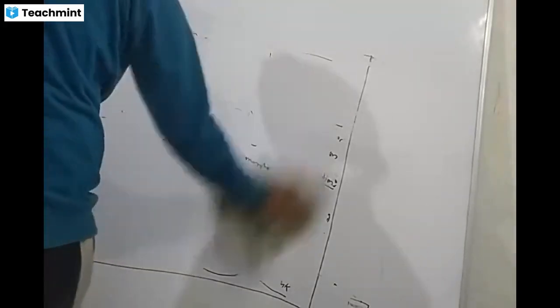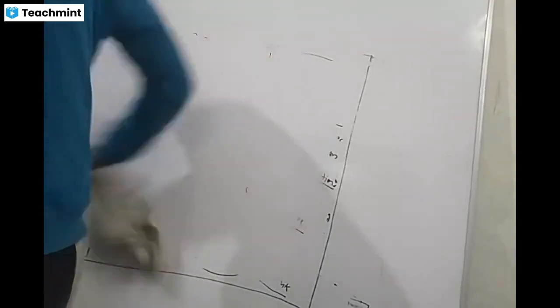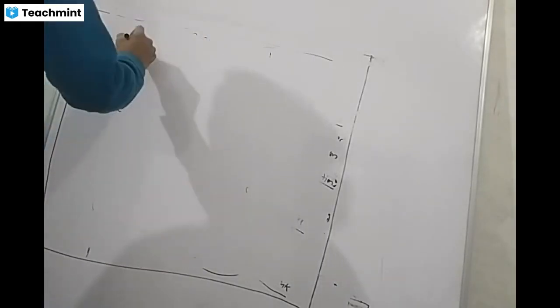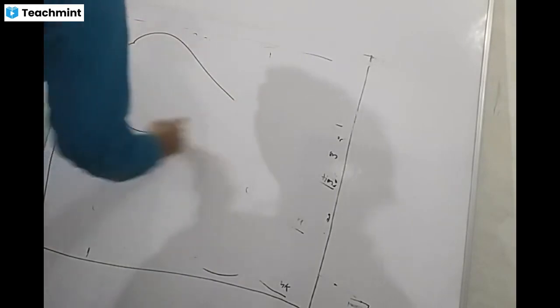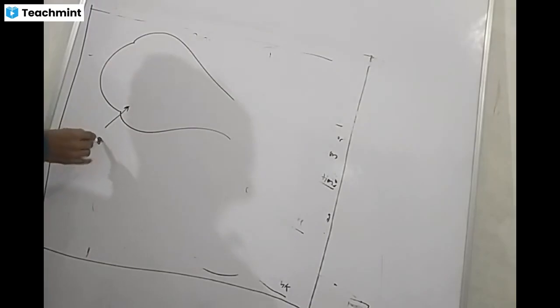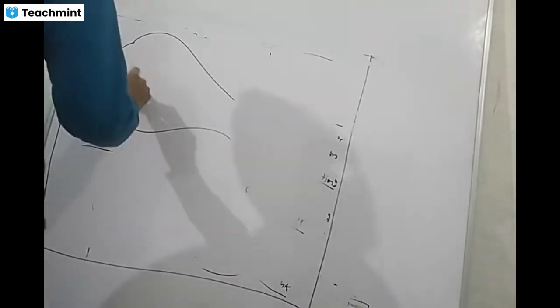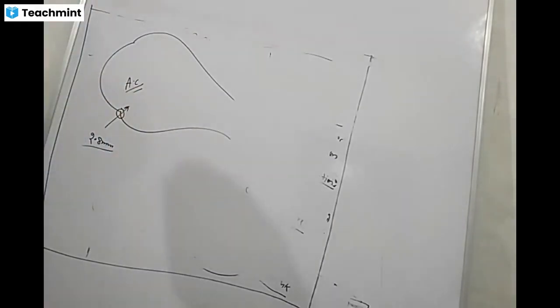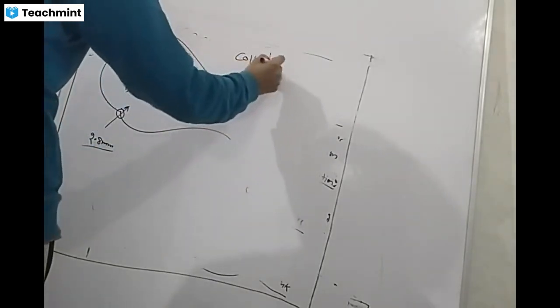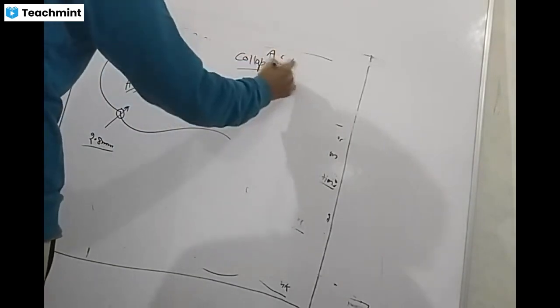Second step. This is the cornea. Suppose we are entering from this point. We make something like a 2.8 mm incision at the limbus. You enter, and now you are in the anterior chamber. During the whole surgery, it is necessary that the anterior chamber does not collapse.